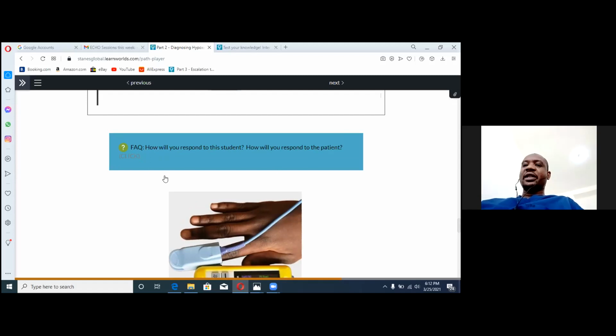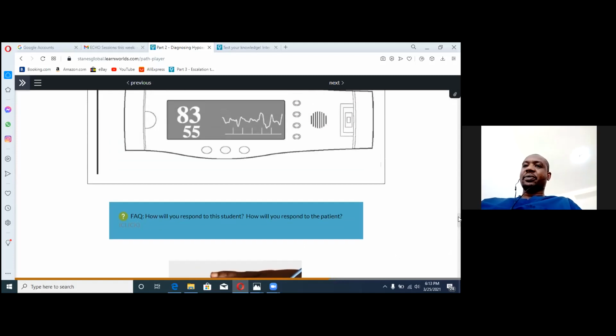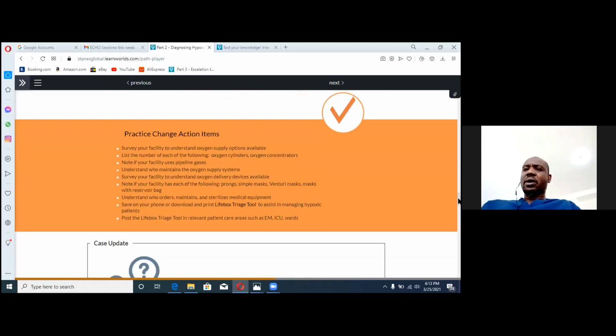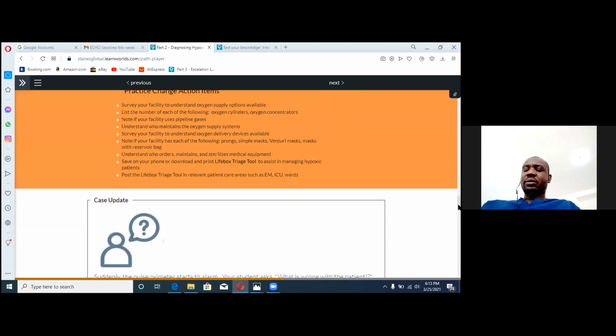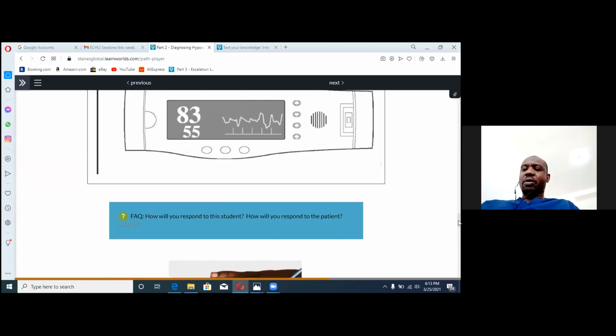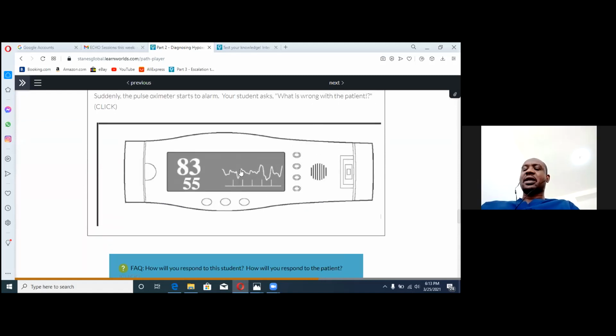Before we click on the frequently asked question, please let's go back to the display. There are some key things that I want to bring out. If you look at the display, you see the saturation is 83%, and the pulse rate is 55.